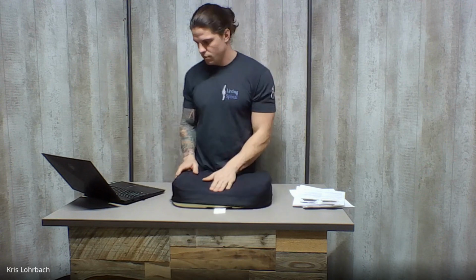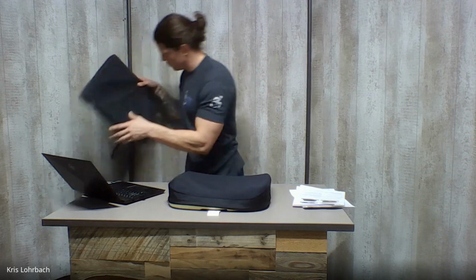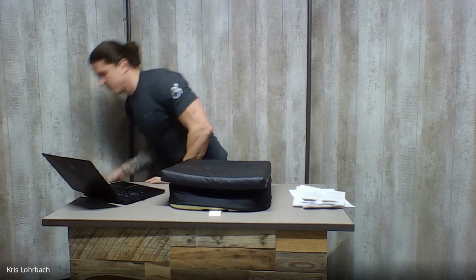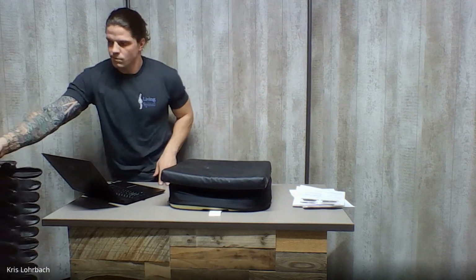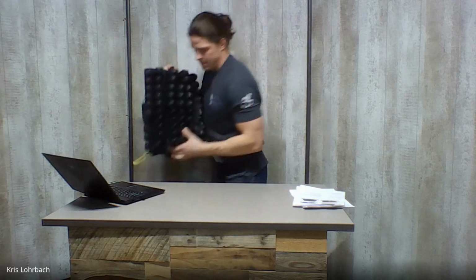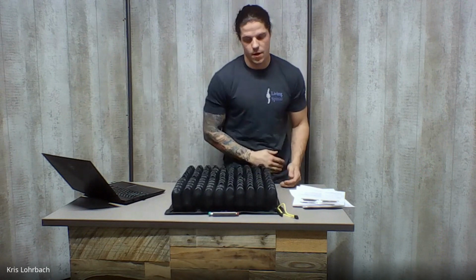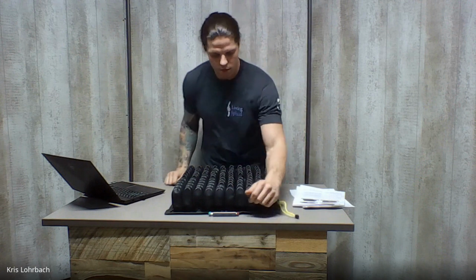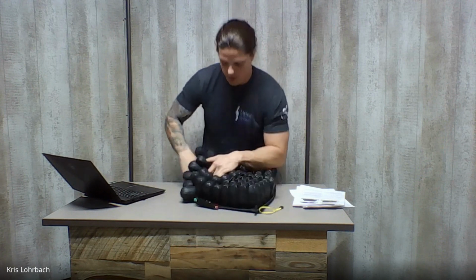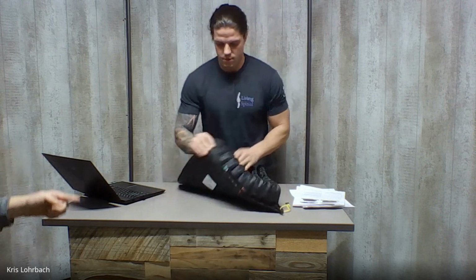Now, if you're a little bigger and you don't have as much strength, and you drag across, you grab that real quick. When you go to drag across that thing, why don't you just show it? In the corner it will roll up on someone. See like that? And so then they're on it, but now it's folded up underneath them. Yeah, and you sit on that. Or it flips up and it's like that.